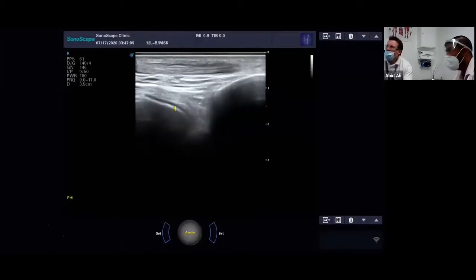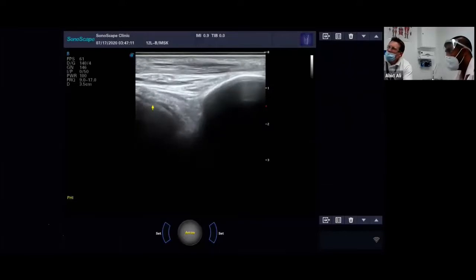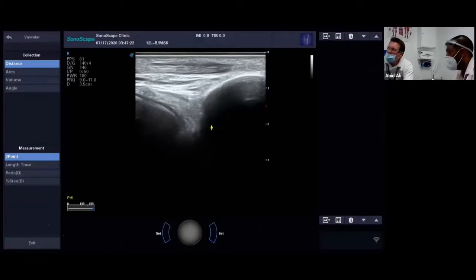You can't see all the way down into the talus, but you can see the periphery of it. And then you've got your ankle mortise. So the ankle tends to get narrower. So let's just measure that for them, shall we, Adrian? Okay. So a typical ankle mortise in a just under 40 healthy male should measure.